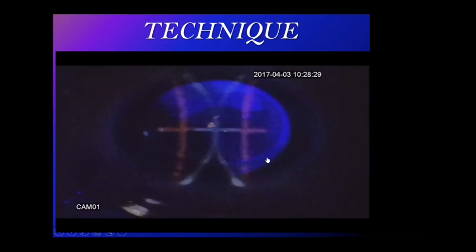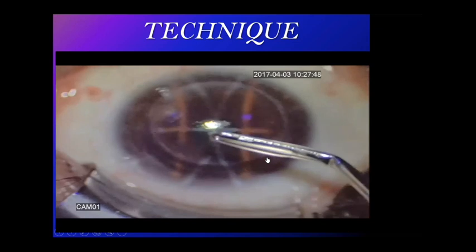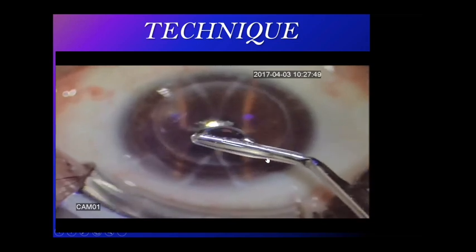You see that now it is getting smoother. There is a question. Is it plain or customized? No, plain. This is all plain. And what is the optical zone here? It's accordingly. You can go up to 7 or 8 or 9, according to the pathology.